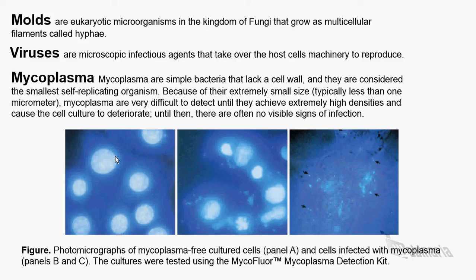However, the only assured way of detecting mycoplasma contamination is by testing the culture periodically using fluorescent staining. The most common fluorescent stain is HOECHST 33258, or ELISA, or PCR, or autoradiography, or some microbiological assays are also available.